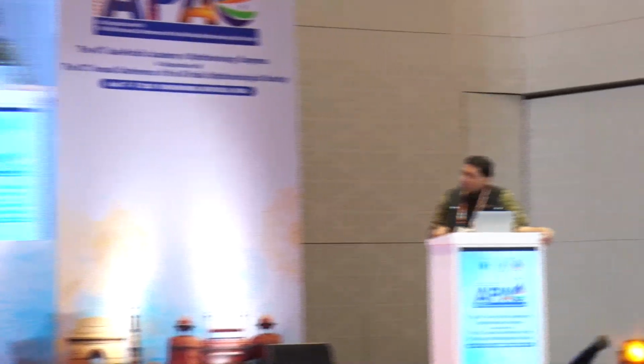When we did not have proper understanding, from a time when Monica was there, Dr. Dami and all of us were part of the Alcon meets, we used to harp about zero aberration concepts. Then we realized the zero aberration doesn't happen because even if you create zero, your lens is going to be taking over from there and one or the other culprits will be there.